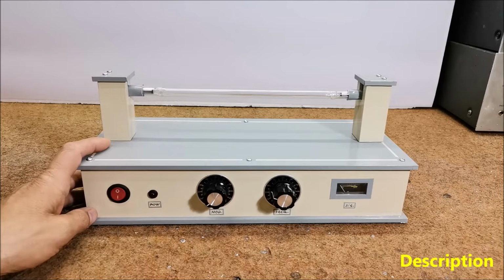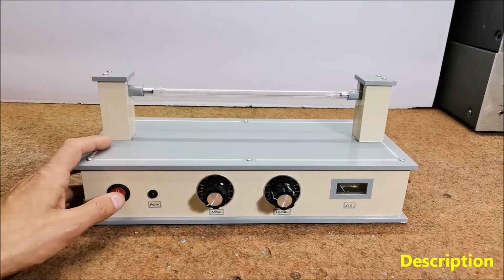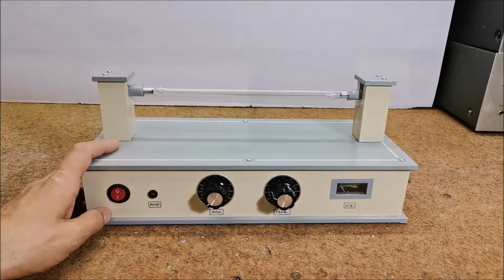Of course, in order to make it yourself, you must have at least basic knowledge in the field of electronics, and if this is not the case, someone who is an expert in this field can make it for you, and it should not cost you a lot of money. If you decide to make this device, it is advisable to watch the previously mentioned videos to make many things clearer.